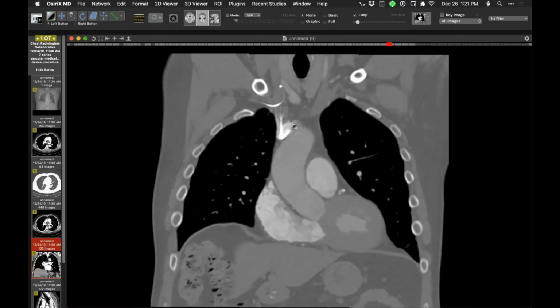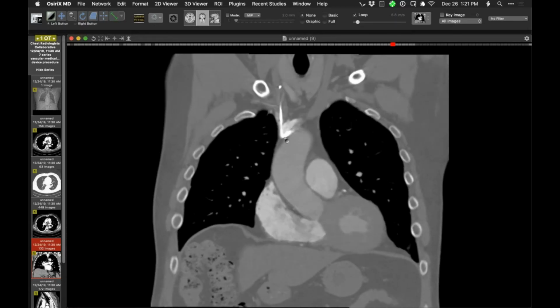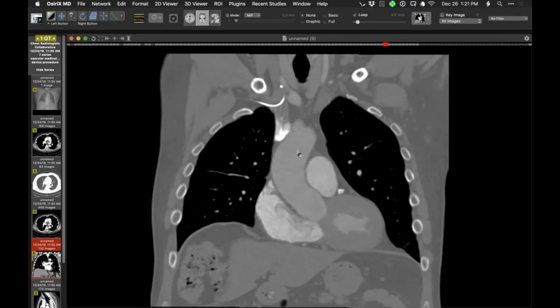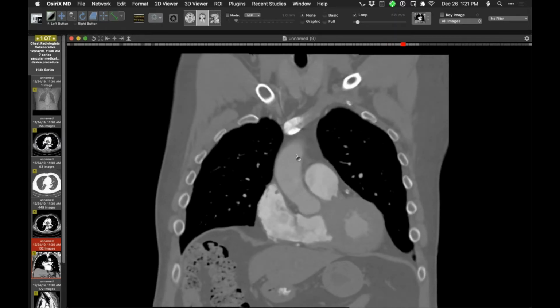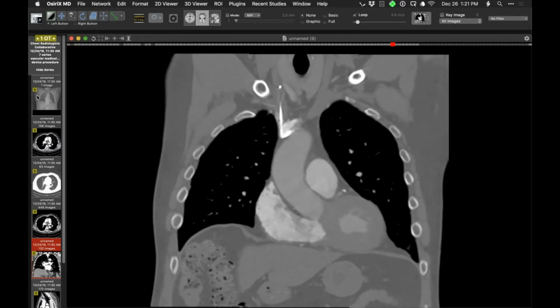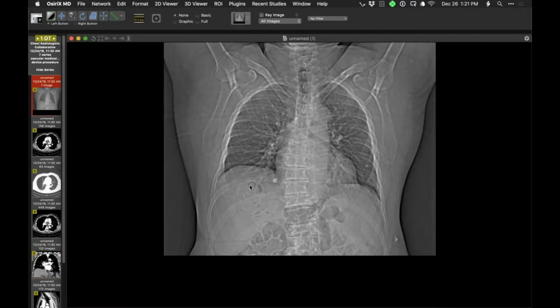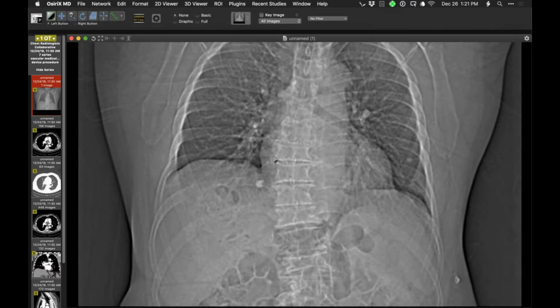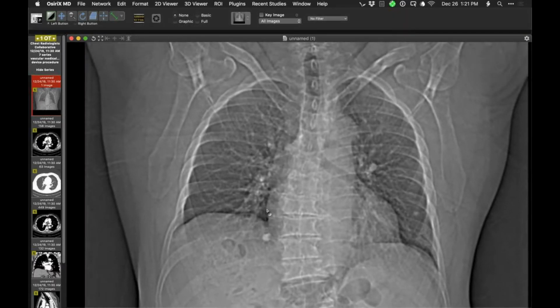it has flipped up into the jugular vein. Contrast comes out of it. It's still a diagnostic exam, but there is the PIC up there. Then I will show you on the scout topogram that the PIC was in the proper position just a moment earlier.